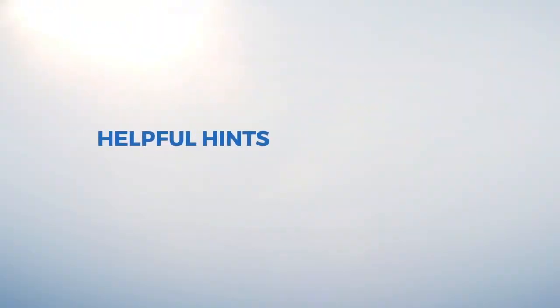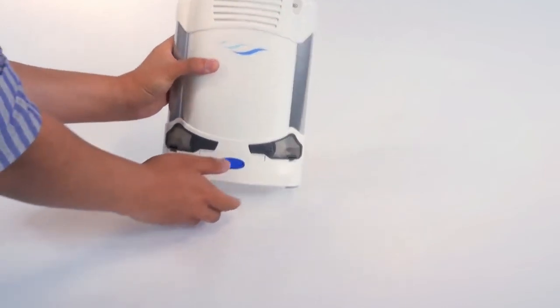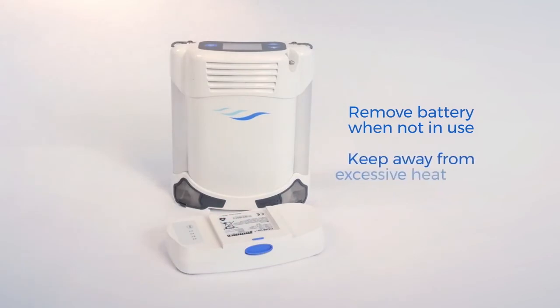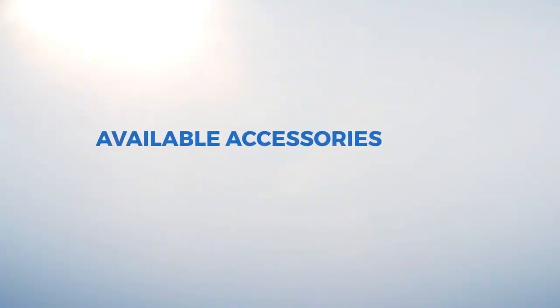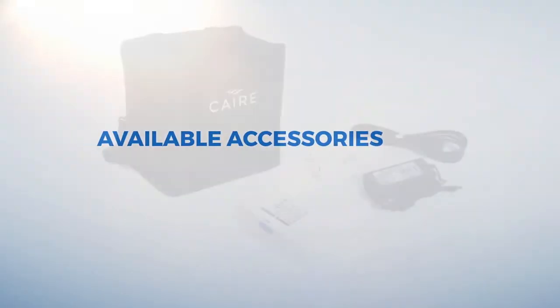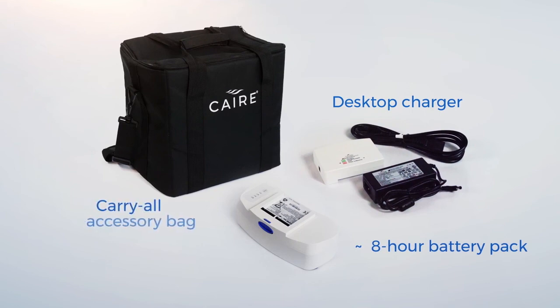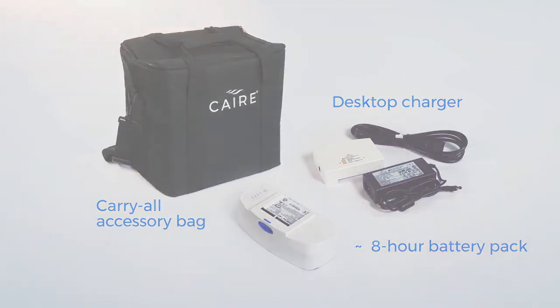When your Freestyle Comfort is not in use, it is recommended you store the unit with the battery removed. Avoid storing any battery pack in a harsh environment, including one that produces excessive heat from direct sunlight or inside a hot motor vehicle. Optional available accessories include a desktop charger to charge your extra batteries, an optional eight-hour battery pack, and the carry-all accessory bag, perfect for carrying your portable oxygen concentrator and all of its accessories while traveling.